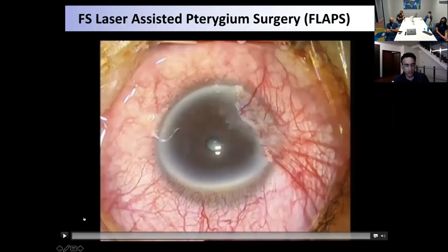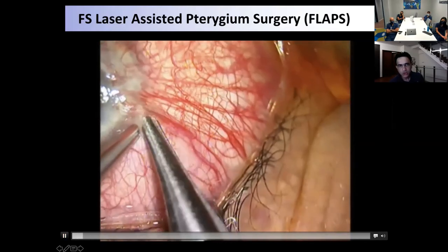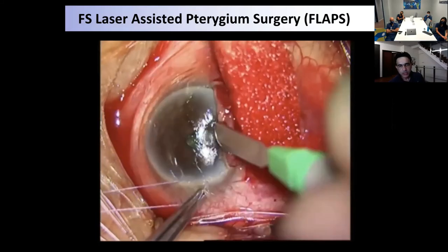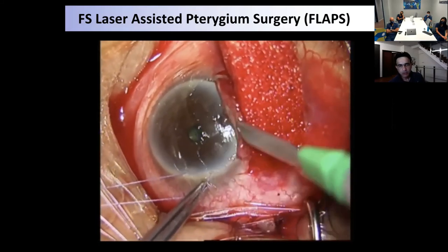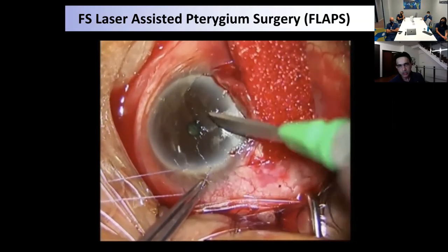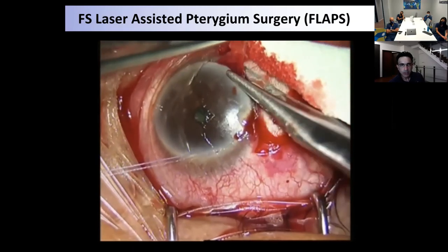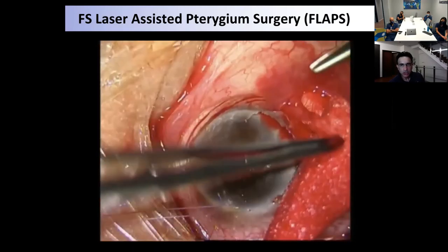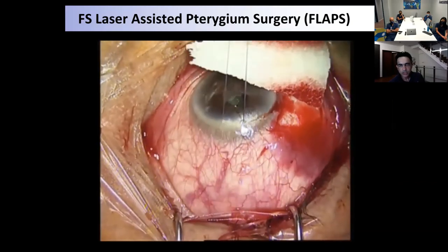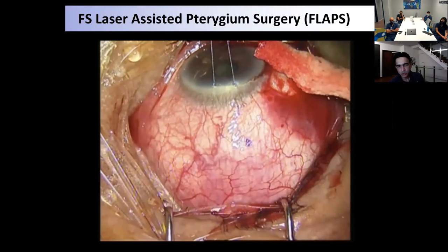Okay, so this is one of the cases. It's not the first case that we did, but it's quite a nice case I'd like to show. You take off the pterygium in the normal manner, taking it from the head, and then you take off the head of the pterygium from the top of the cornea. This is just the standard technique that you normally use. While you do this, you do a tenons resection and try to make sure you've got a nice bare scleral bed. Then the eye is rotated down. We mark about 4 millimeters back away from the limbus. I normally use calipers just to mark.